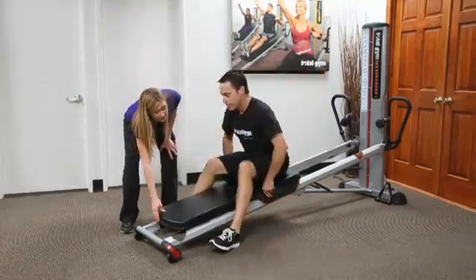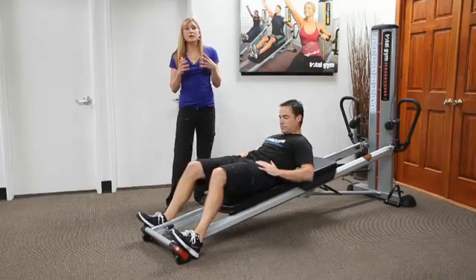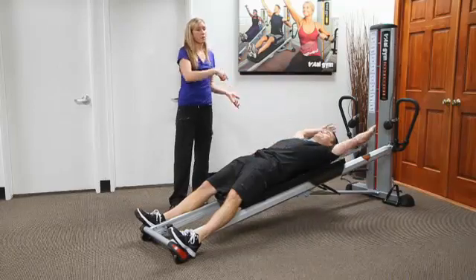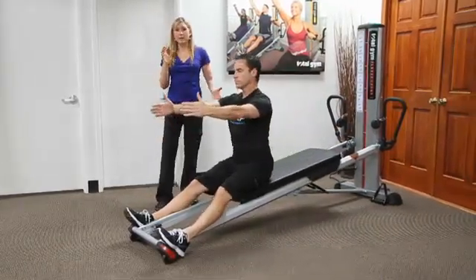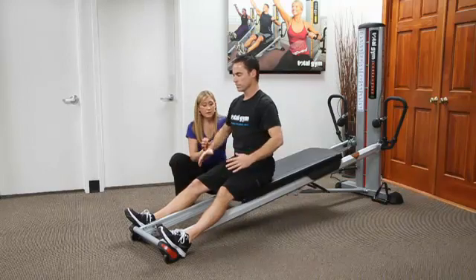So I'm going to have you stand up and sit at the very edge of the glide board. Your feet will go right at the base. And I love this for the fact that this allows for some proprioception and some awareness of what the pelvis is doing. So let's say we're going to work on a roll up. So we have people roll up and down. And oftentimes we see a hinging happening at the spine. So I'll stop someone and I'll have his hands come down just a little bit. And he can put his hands on his pelvis for feedback.